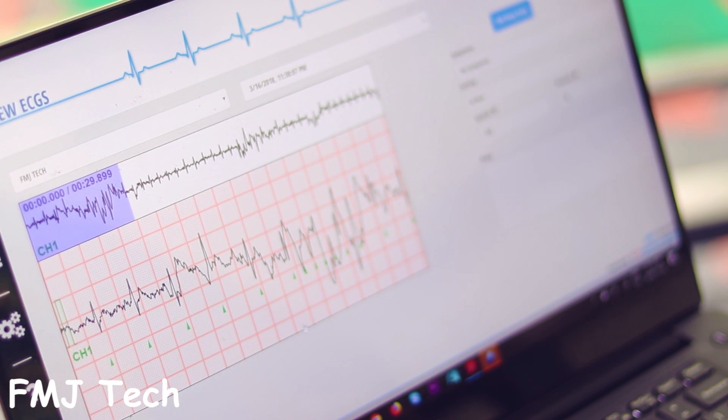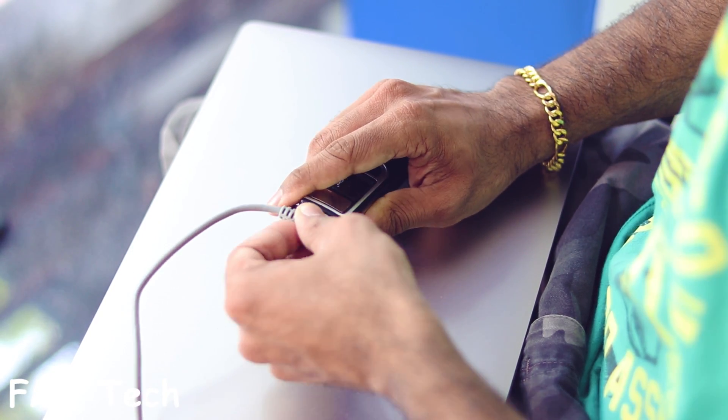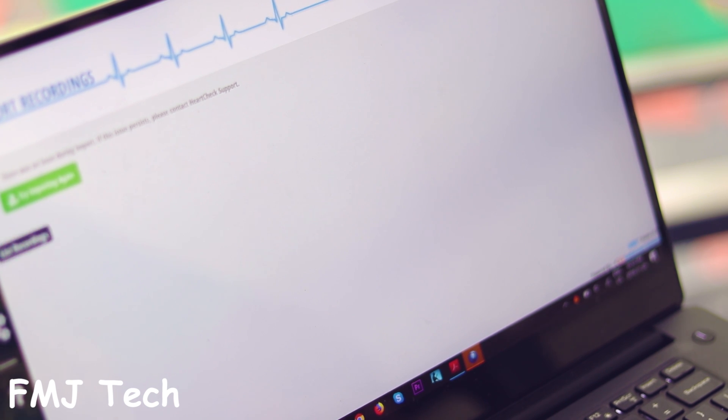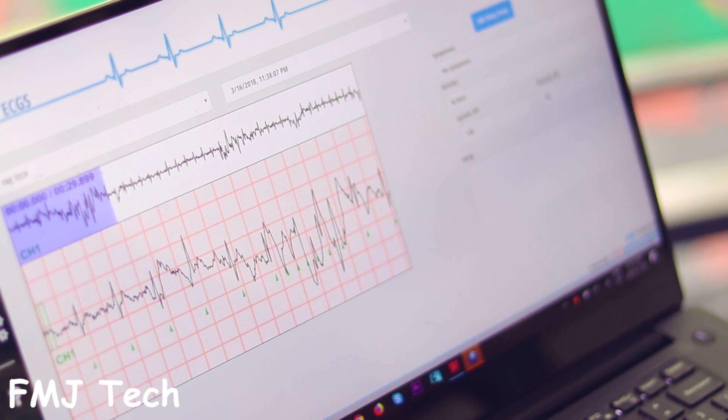So simple, right? To get the ECG reports on your PC, you have to install software called GemsPC. Connect this device to your PC using the USB data cable provided and register your device using the software. Once registered, you are all set to get your first reading analyzed by a qualified physician free of charge online. It's very easy to send the ECG reports for analysis.